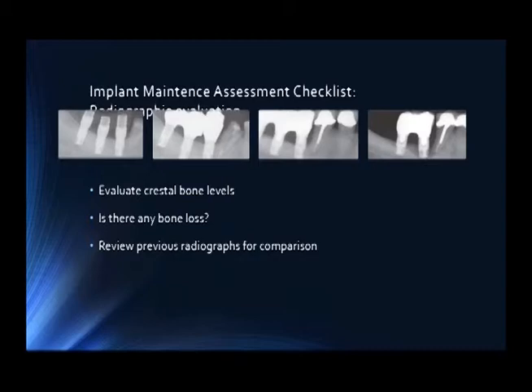Are the areas the same? Are we losing any bone? Are we monitoring it correctly? We need to take radiographs to monitor so that we can use the threads to aid us in identification of areas of concern. Usually, they say ideally it would be the same clinician in the same room with the same setup to do the radiographs, because that would make it all the more consistent and easier to evaluate. Although this doesn't always happen, that would be the ideal.